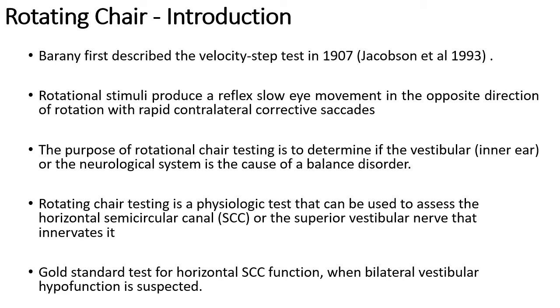So it's understood that the rotational stimuli will produce a reflex with slow eye movement in the opposite direction of the rotation of the chair, with a rapid contralateral corrective phase. The examiner also notes a weak or absent response generally denotes bilateral loss of the vestibular function.